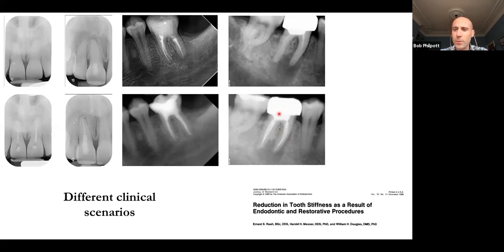But I always worry about what will happen in terms of the retention of the restoration. It looks identical two-dimensionally on the radiograph. And although the emergence profile of the tooth, and you could say they're even overhangs as opposed to just a bulbous emergence profile, the margins of it clinically and radiographically appear to be sound. I've accessed through it. Ultimately, the outcome has been a successful one, but equally you wonder about the retention of your restoration afterwards.